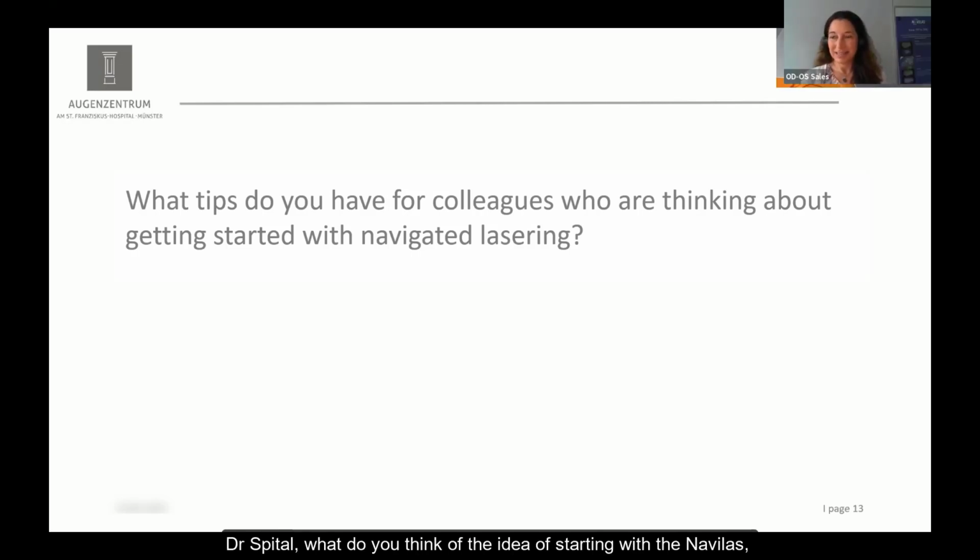Dr. Spital, what do you think of the idea of starting with the Navilas, then after the first few laser treatments going back to the slit lamp to assess the effects there and get a feeling for how it looks on the screen of the Navilas?